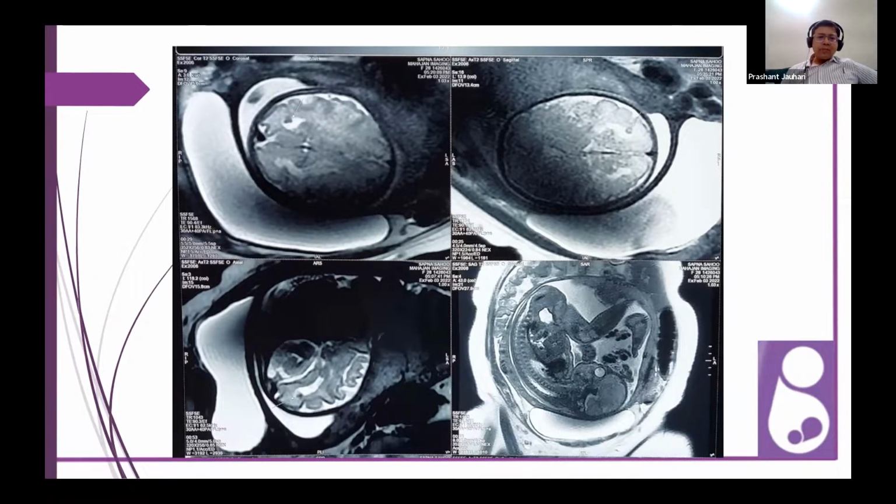So I would take them to be some nodules which are there. But apart from this, there is some dilatation of the ventricles, maybe, which is evident here. I'll tell you the report. I just wanted to show that these same dots that we are seeing were projecting into the ventricle. There was nothing in the gray matter. These were the only two findings on the fetal MRI.